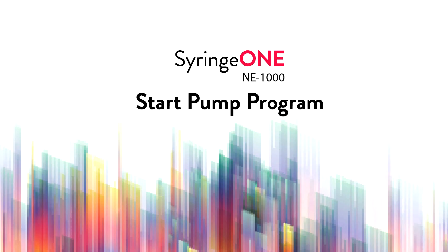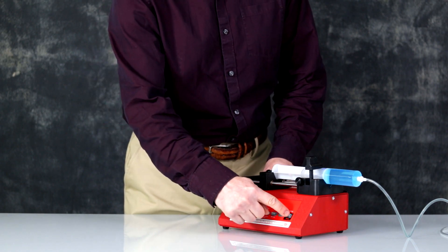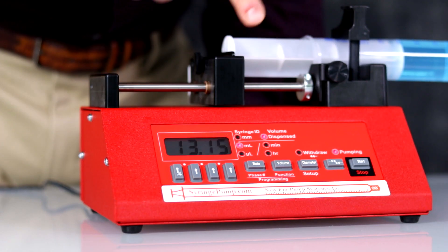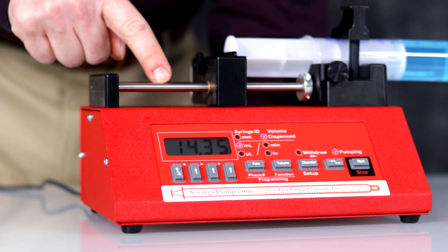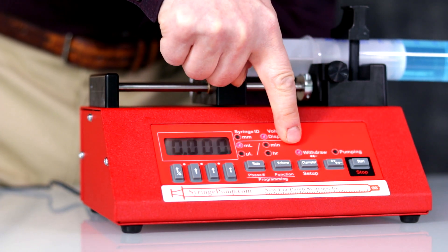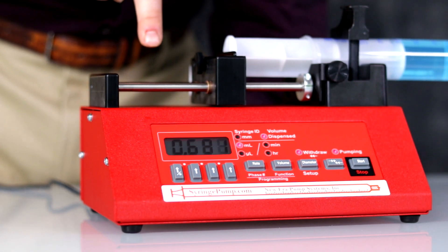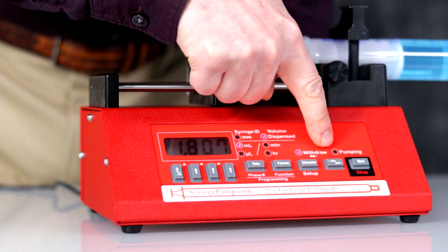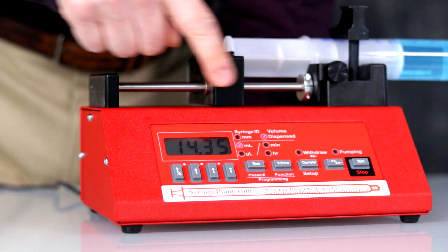NE1000 start pump program. To start your pumping program, simply press and release the start key. Now the pump is pumping. The pump will continue to pump continuously until you stop the pump. To withdraw, change the pump direction using the direction key. Press the start key. The syringe is retracting and pulling from the syringe. Blinking LED means the pump was paused. Now we're set for infusion again.